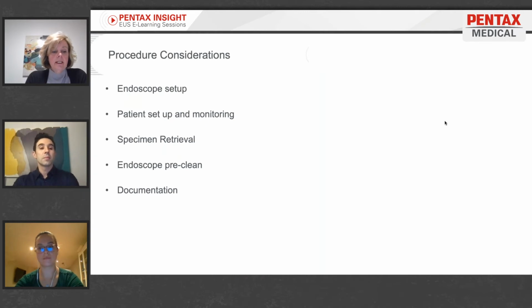So I guess the main nursing considerations for the procedure consist of the setup and the post-care of the endoscope, monitoring the patient, and assisting with therapeutic and tissue retrieval and documentation.